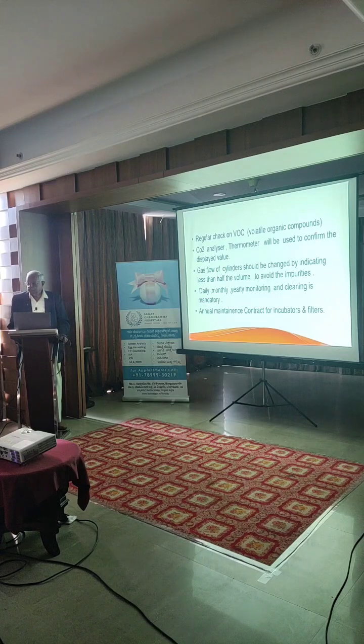When we enter into an AMC with any of those companies which supply these instruments, you have to be after them, because they will not come on time, they will not do the servicing properly. Even post-servicing, we have to make sure that they do the proper job, and then we have to cross-check with them if there is anything that has to be replaced or attended to.